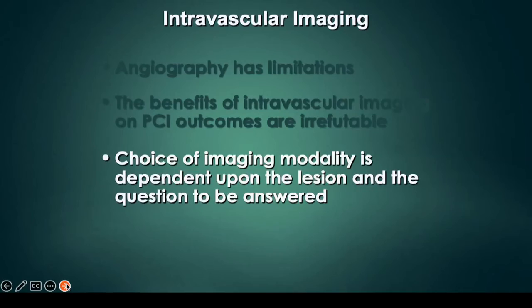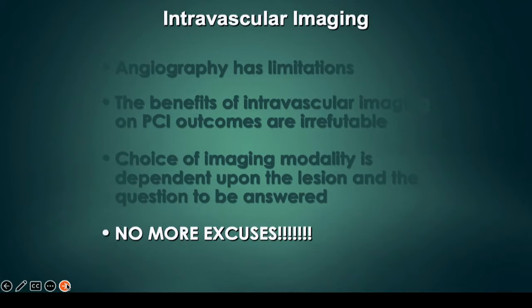And the choice of imaging modality basically depends upon the lesion and the question you need to answer. In ACS, it's the OCT. For left main, it is IVUS which is more important. The gentleman asked a question, should we do OCT in all the ACS cases? Dr. Mamas, in his concluding remarks, told us in all the ACS cases we should do OCT, but our socioeconomic strata will not permit that. So which cases in India should we be doing imaging in ACS?